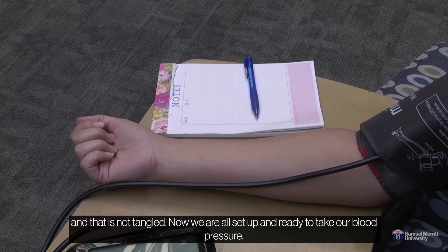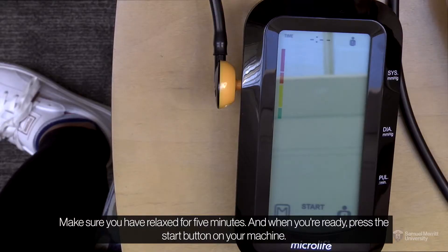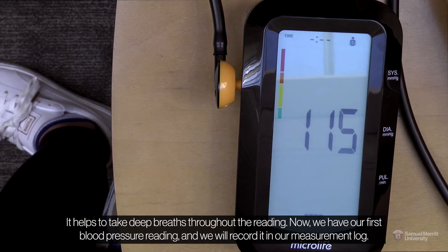Now, we are all set up and ready to take our blood pressure. Make sure you have relaxed for five minutes and when you are ready, press the start button on your machine. Do not talk, move, or cross your legs when taking your reading. It helps to take deep breaths throughout the reading.